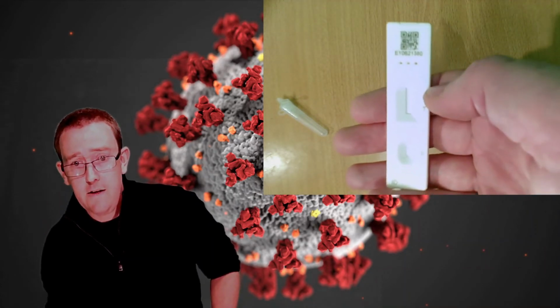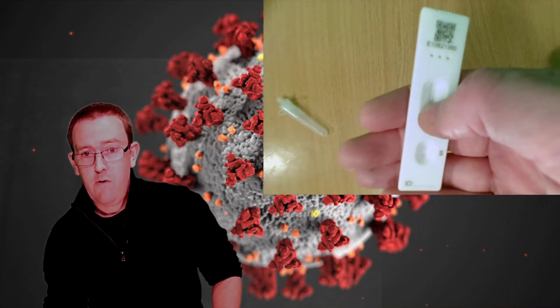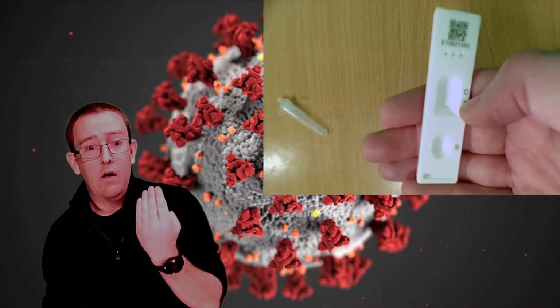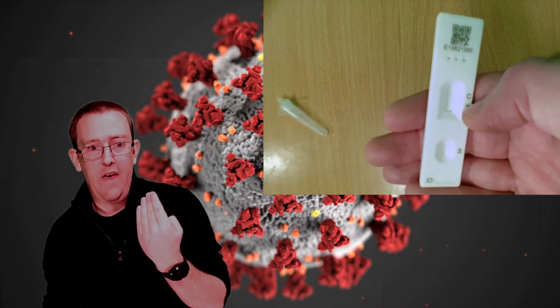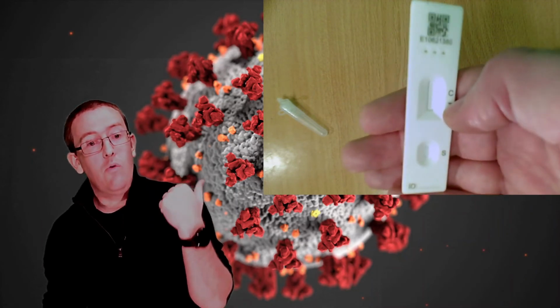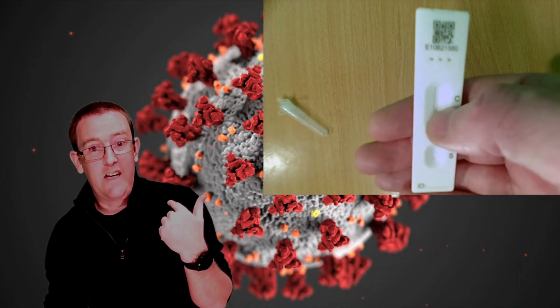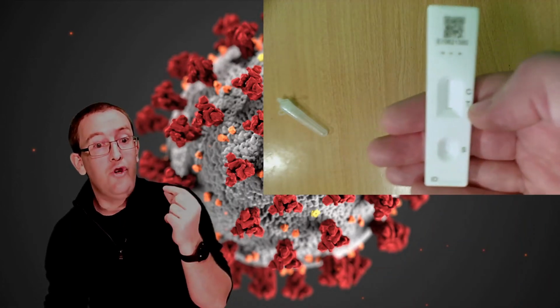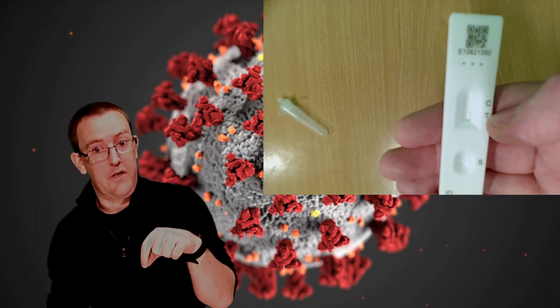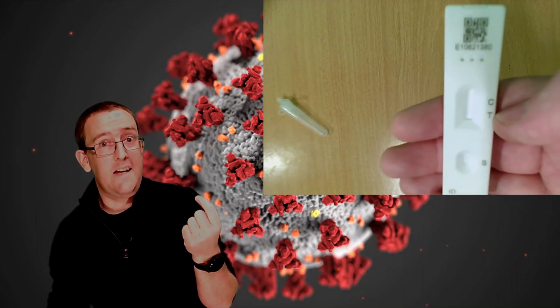And you've got test and control, just like a pregnancy test, as I say. In that window there's a little band of antibodies that are stuck, and they are going to stick to any COVID particles that are there. But the liquid already had an antibody in it with an enzyme on the end that will also stick to the COVID antigen. So basically, the COVID antigen, if it's there, will glue together these two forms of antibody, one that's stuck to the stick and one that makes a colour. And you'll get a coloured band there, and that's an indication of a positive.